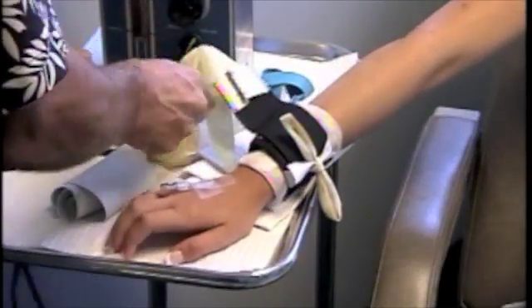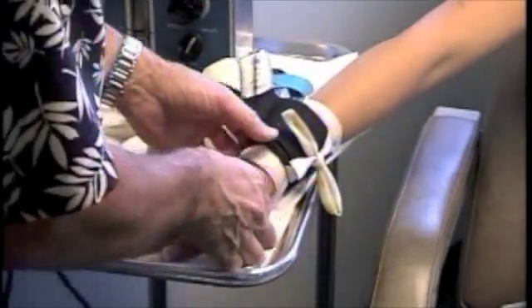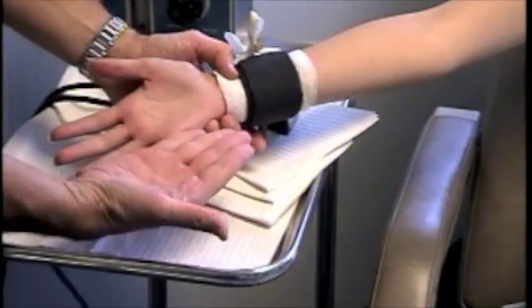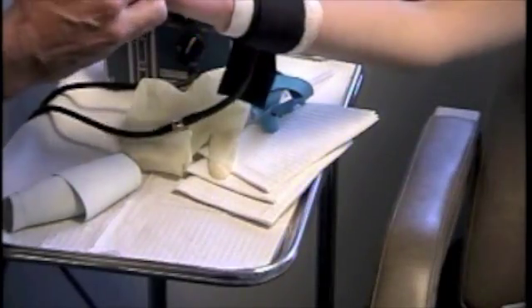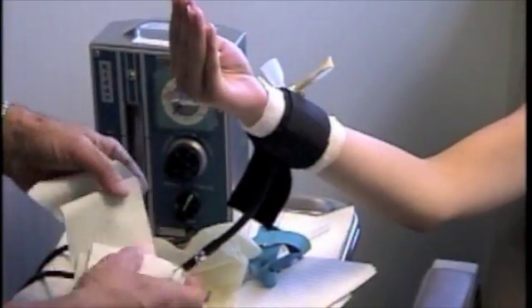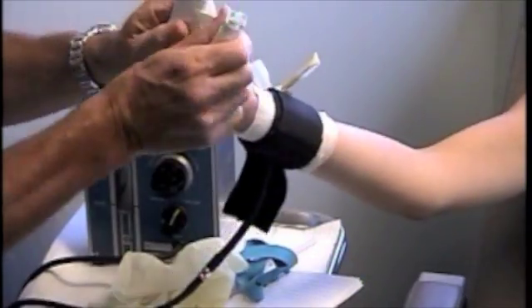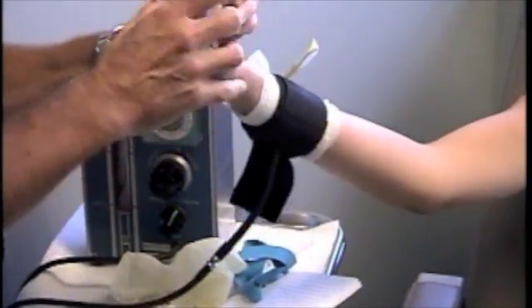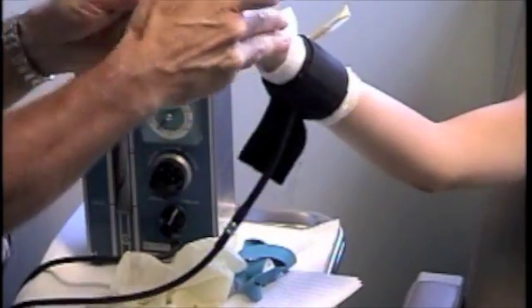Using this technique, the 50 or so injections that I'll be giving her in her hand will be painless, versus other techniques such as using ice or creams on the hand that wear off and essentially don't work. You can see right now her hand is pink, just like mine, because the blood supply is full going through her fingers. I'll be using the Esmarch flat bandage to squeeze the blood from her fingers down her hand and past the tourniquet, then inflating the tourniquet so no new blood comes back in, which will allow me to inject xylocaine through the IV to numb her hand so the injections will be painless.